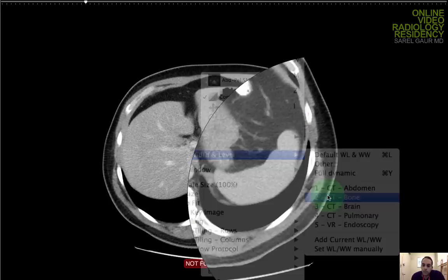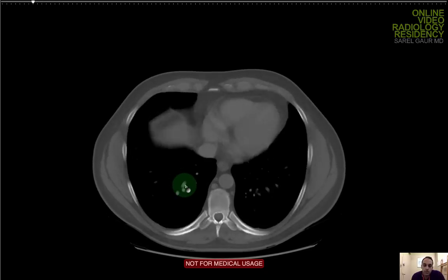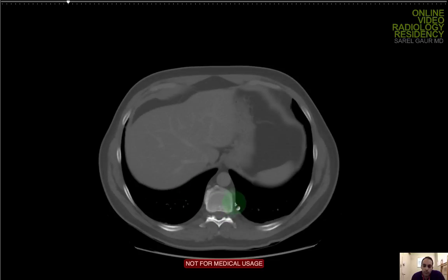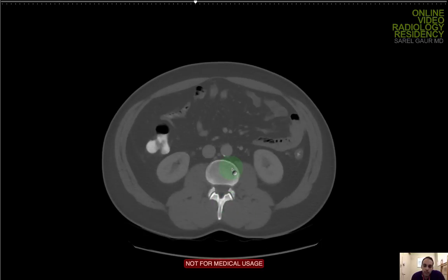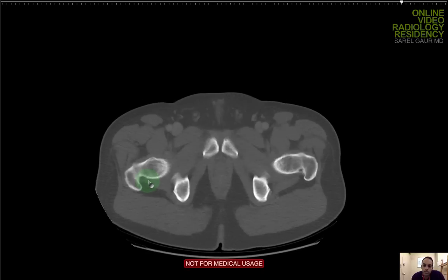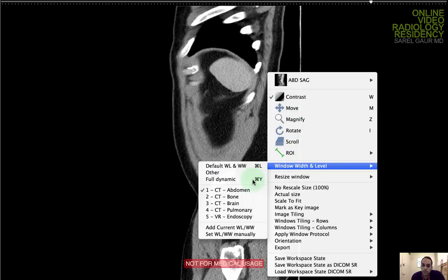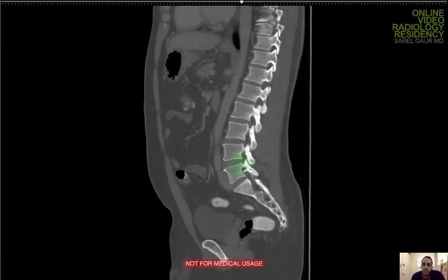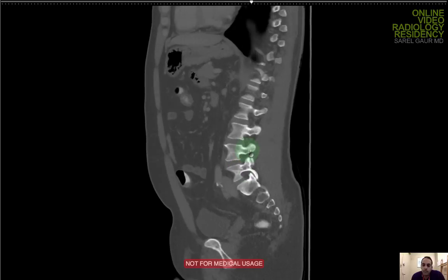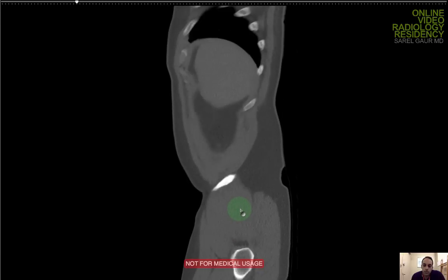Switching to bone windows. Looking at the ribs on the left and right for any focal lesions — sclerotic or lucent lesions. In the setting of trauma I'd be looking for fractures. Looking at the spinal column, pelvic bones, and proximal femurs — not seeing any fractures or abnormalities. I like showing the bones on the sagittal plane — it really shows the spinal column to advantage. The spine is filleted here: no compression deformities, nice normal alignment. I also flip over to check each hip joint in the sagittal to make sure I'm not missing any fractures.